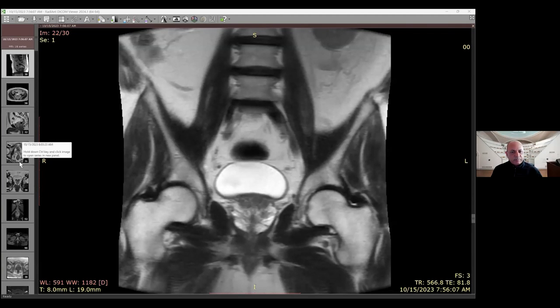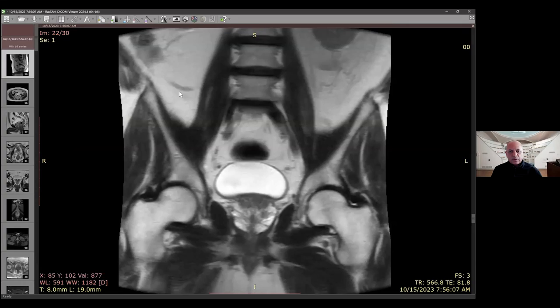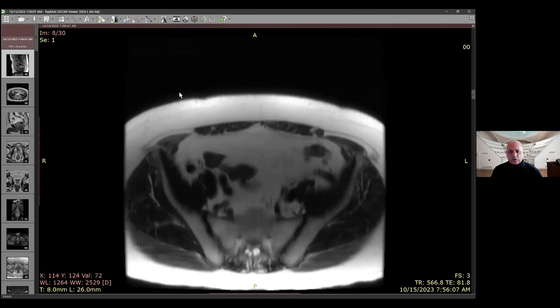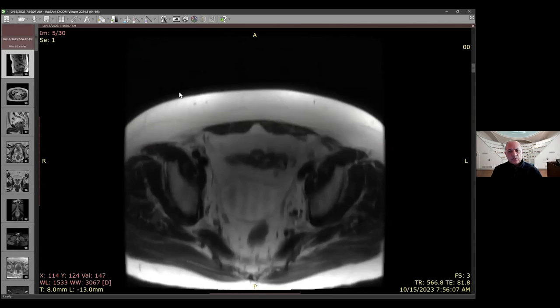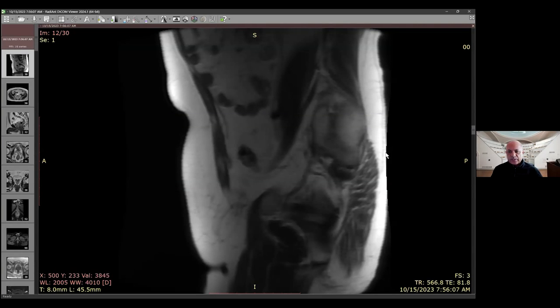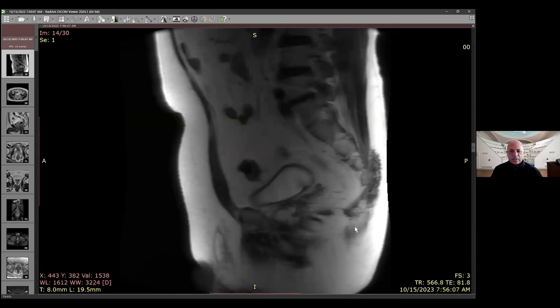As mentioned, we do triplane T2. We start with the localizer — it's also a good check for the technologist to know they are covering the relevant anatomy and there is adequate signal. We don't use an endorectal coil in our practice, so we rely on the high fidelity of the phased array coils. When they look at this scout, they confirm there is good signal anteriorly and posteriorly and the coil channels are working well.